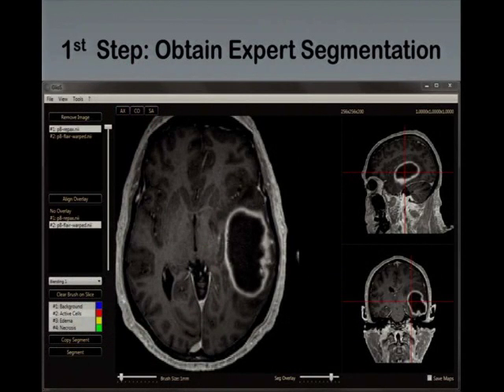So we, first of all, need to create the label database. So that's the key ingredient for our machine learning-based approach. We need to have a good number of patients, and for all of those, we need to have the ground truth labeling. We need to have an expert, like a doctor, who knows what a tumor looks like and what the different tissue components look like, and can actually come up with this map.